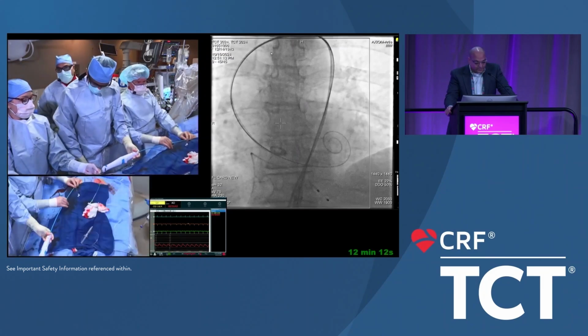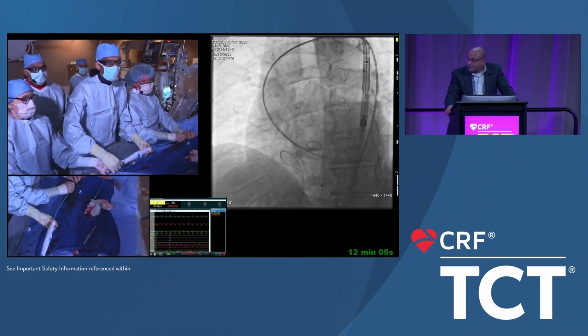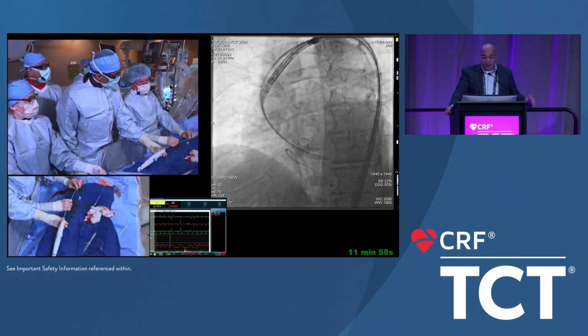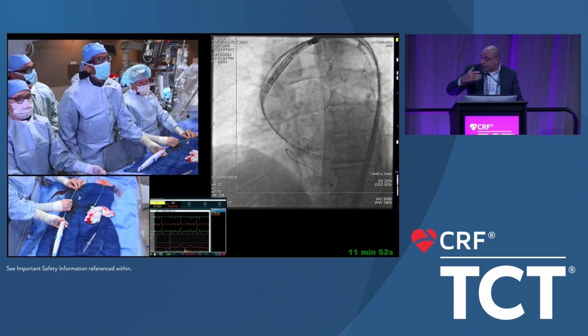So we go by the average diameter of our perimeter, and we go by -1, and we use a true balloon, and we hit it every single time, which is exactly what you did here at the end. But I want to make sure the audience knows that, in my opinion, it's very important to pre-dilate these valves. We were more conservative, though, just to be clear. And actually, we were talking about this over here as well. So I think everybody should comment on how they do it.